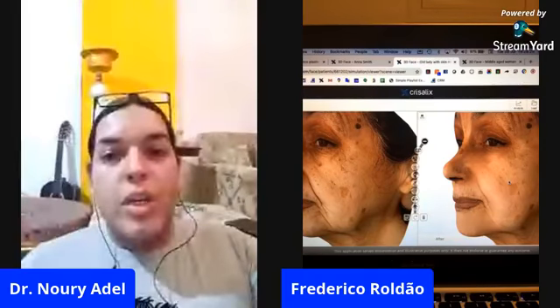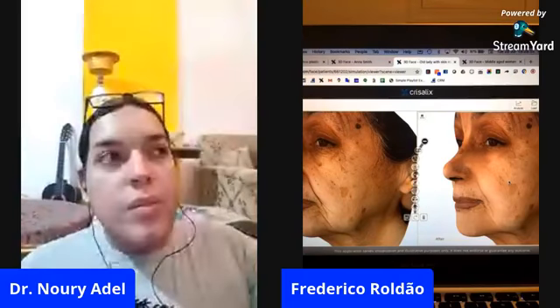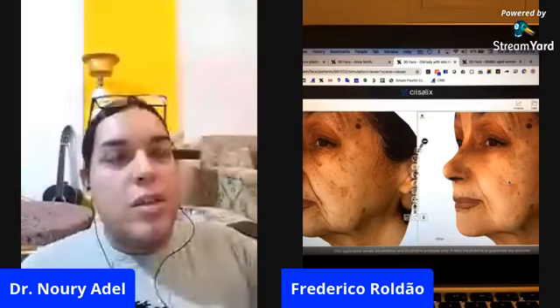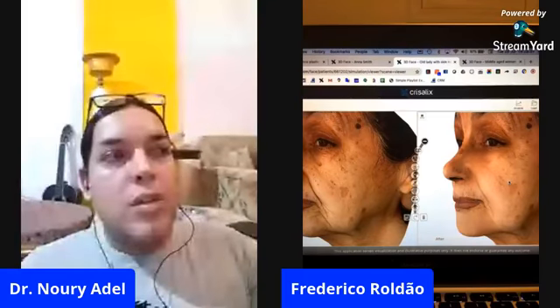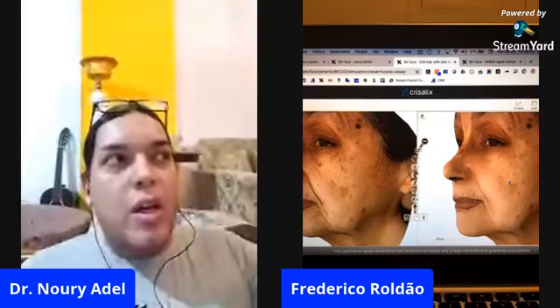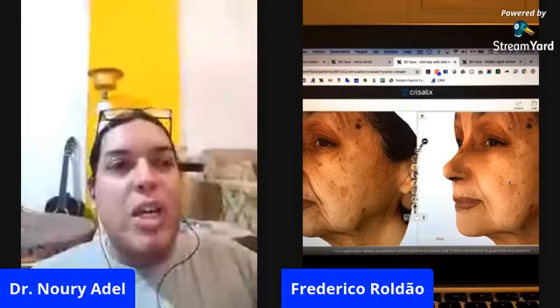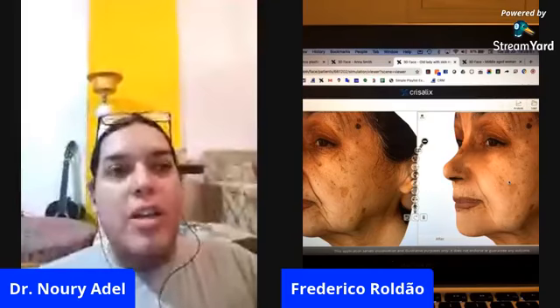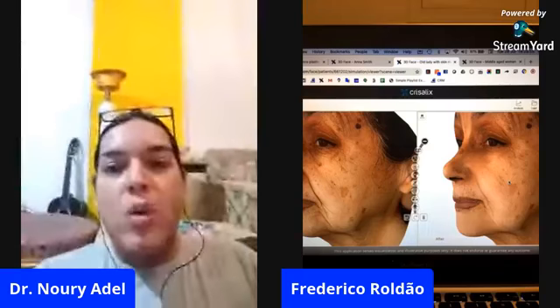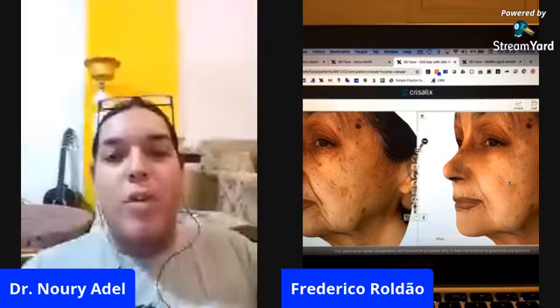I think you are doing it beautifully. Is this something that is common in Egypt? To have this magnification factor thing? No, I mean to have 3D imaging software. Yeah, it's not very common, but of course we do a lot of CBCT, we do a lot of 3D pictures, but we don't apply virtual aesthetic software into our practice very much. That's why I was very interested in the topic, because it's not something you see on a regular basis.